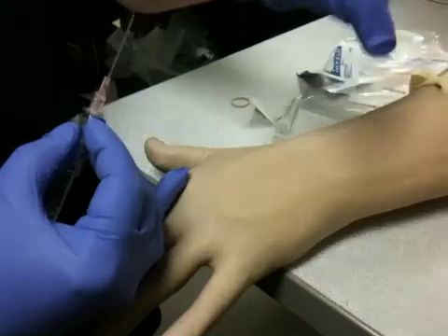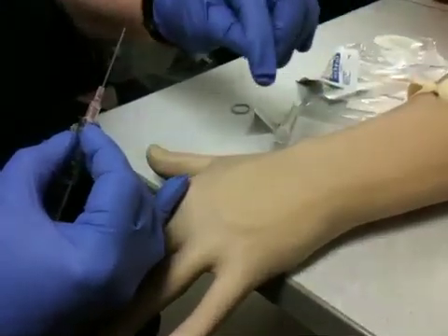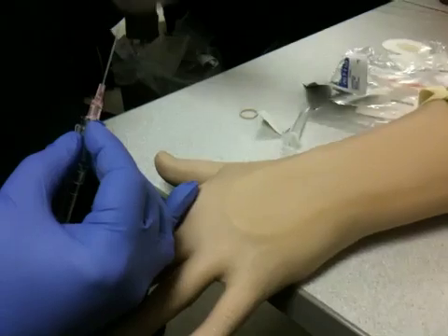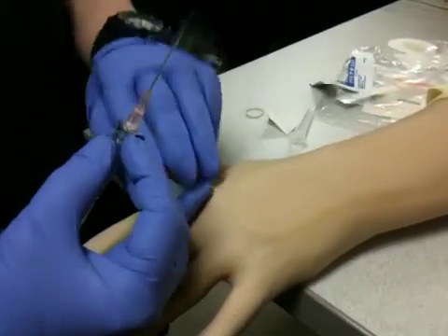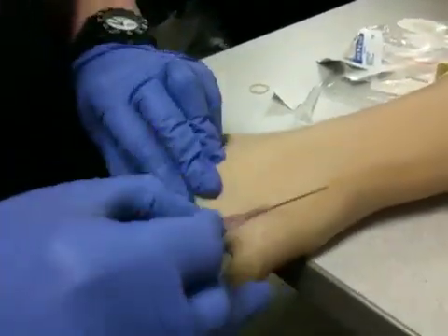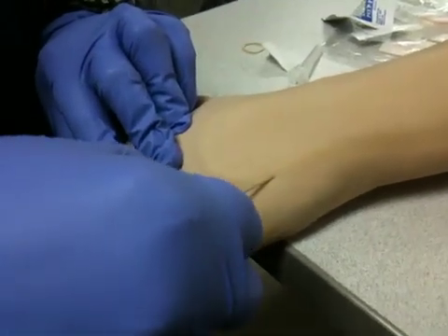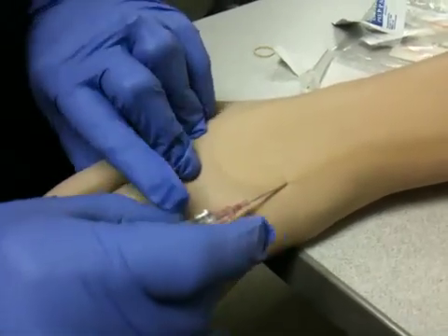Now, I do not want to touch where I have cleaned. If I palpate it with my fingers, I've got to go back and clean it again. So very sterile. At what degree angle? 30 degrees. I make a stick and I get a flashback.